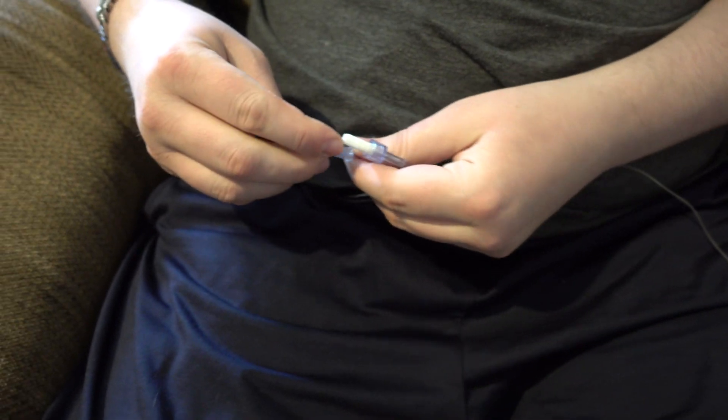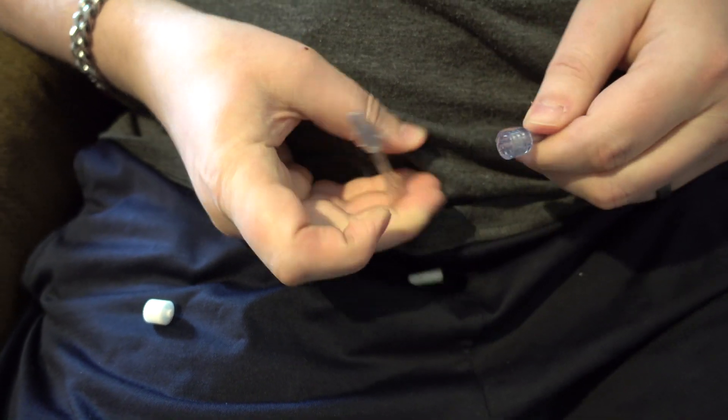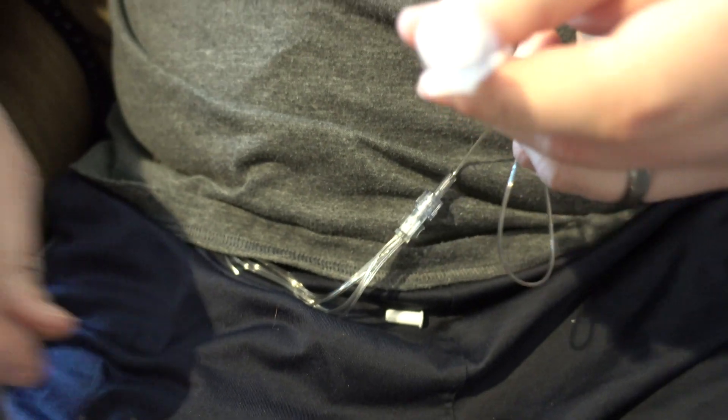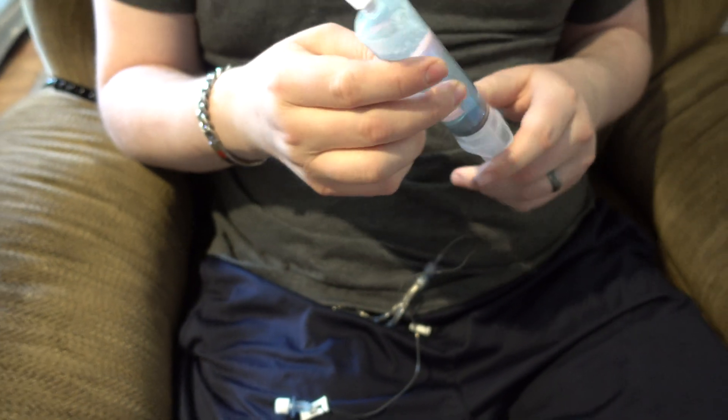So now I've got my flow rate tubing, I've got all my sites set up, and I'm about to hook my flow rate tubing up to my site tubing. I'll get this one done and get these screwed together, then I'll leave this cap on until I've prepped my syringe.